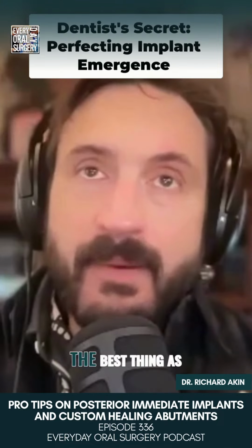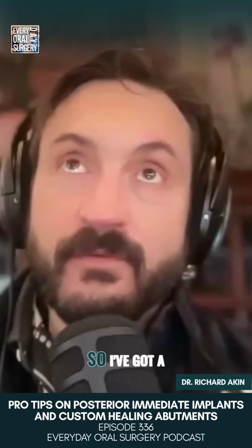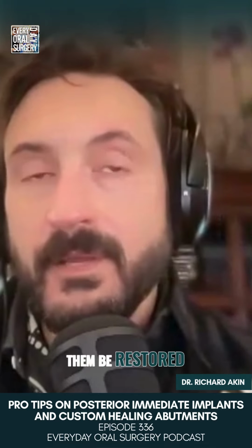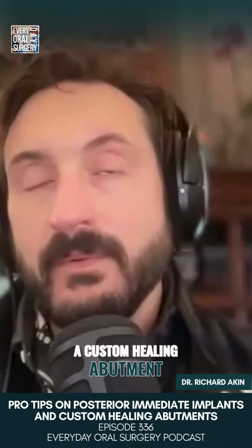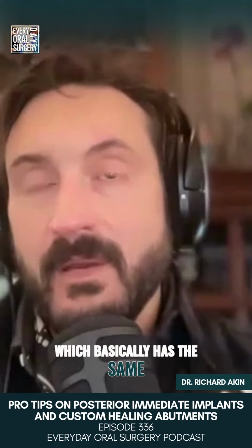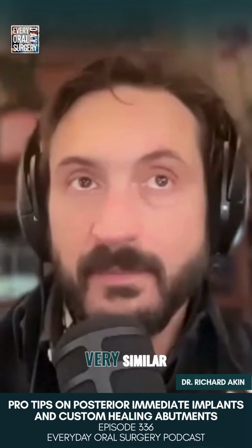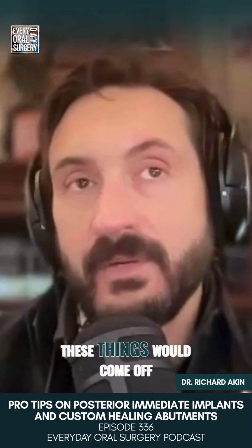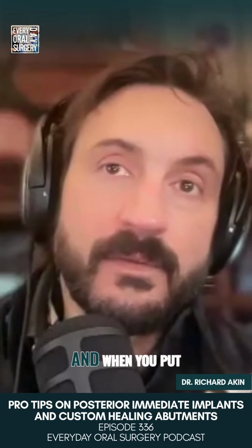I think the best thing was that I would watch the dentists restore these. In the first one and the second one, I did go and see a number of them be restored. When you take out a custom healing abutment, which basically has the same subgingival contours as an anterior provisional, it looks very, very similar in cross section.